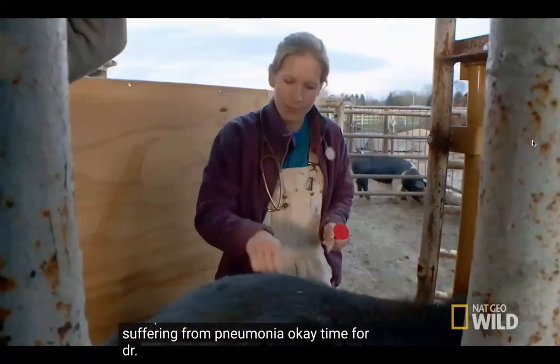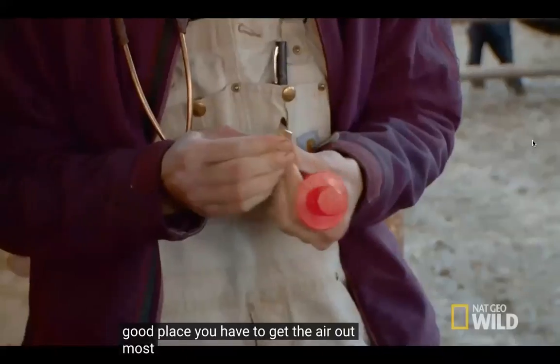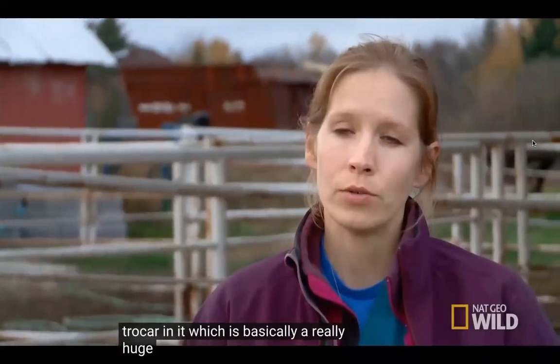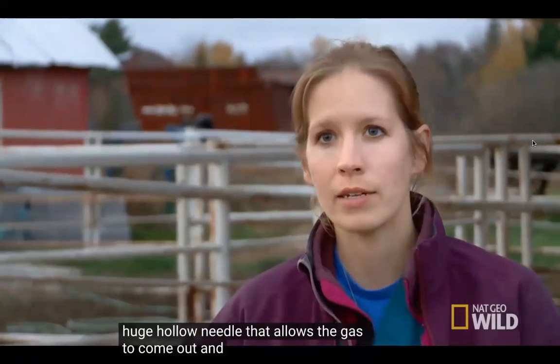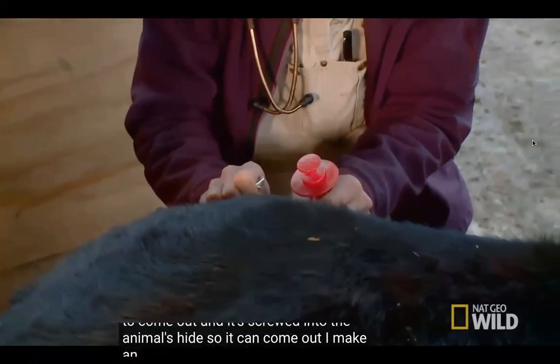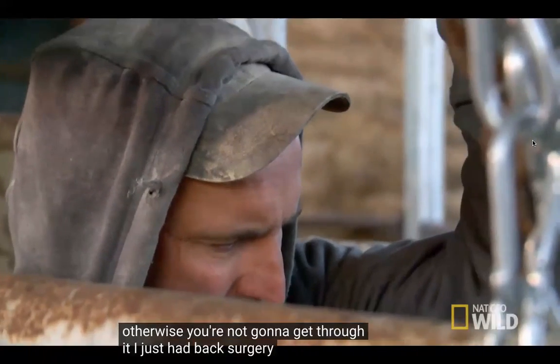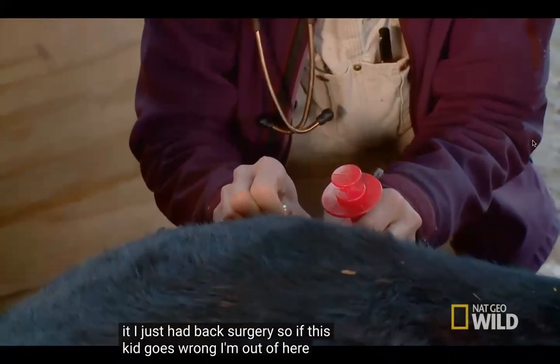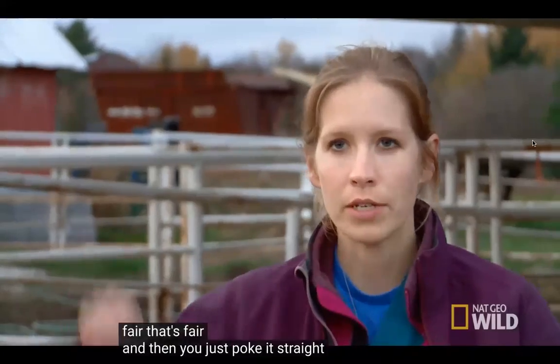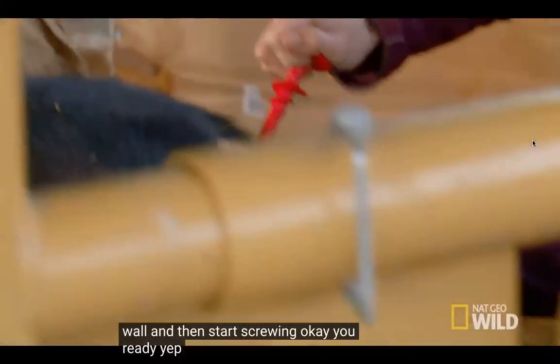Okay, time for Dr. Emily to try to provide some relief. That's a good place. We have to get the air out. The most long-term way to do it is to put a trocar in it, which is basically a really huge hollow needle that allows the gas to come out, and it's screwed into the animal's hide so it can't come out. I make an incision into the skin because otherwise you're not going to get through it. I just had back surgery, so if this goes wrong, I'm out of here. That's fair. And then you just poke it straight through the muscle walls, the rumen wall, and then start screwing. Okay, you ready? Yep.